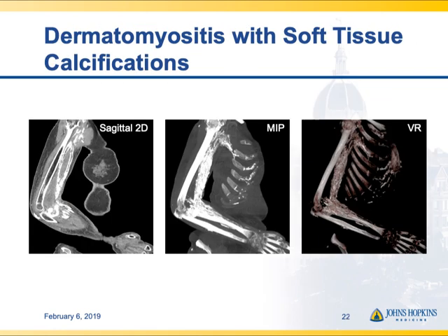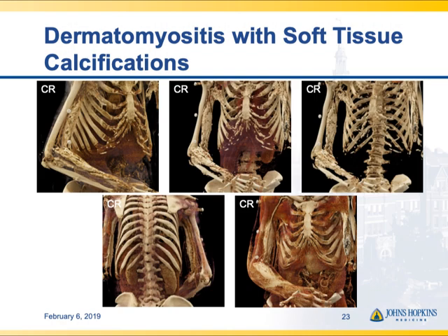Here's an interesting case: a patient with dermatomyositis with extensive soft tissue calcifications extending throughout the muscles of the upper arm and forearm. The MIP images nicely bring out all the calcifications, but the cinematic rendered images show the relative positions of calcifications compared to vascular or nervous structures, as well as the texture and density of the calcifications, with higher definition than volume rendering.